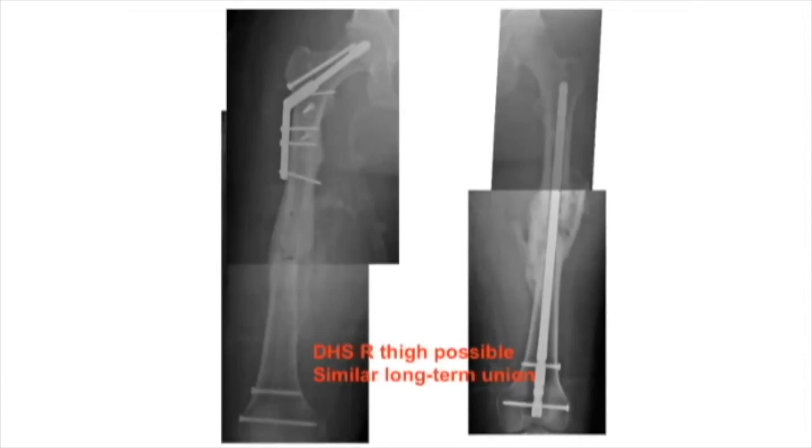Is that because of the strength of the implant or because of the callus? Both. Because the thing is, I'm feeling good with both. I'm feeling, okay, there's callus, that's good. That's a good sign that there's good biology going on. And it's relative stability, so they're going to be able to auto-protect themselves to a certain degree, but at the same time, I'm also confident in the implant that I have. I know that the amount of cyclic loads that they're going to induce upon that implant, it's probably going to outlast that of a metal implant. So for me, I'm saying, okay, fine, the combination of both are allowing me to weight bear a lot sooner.